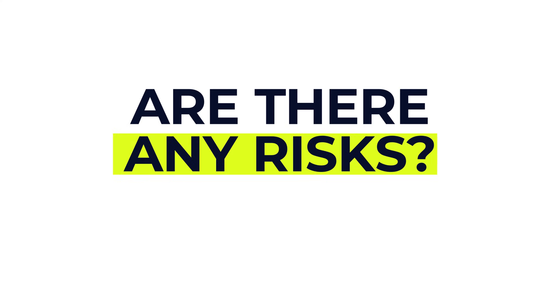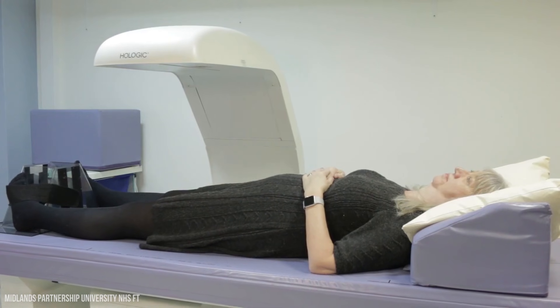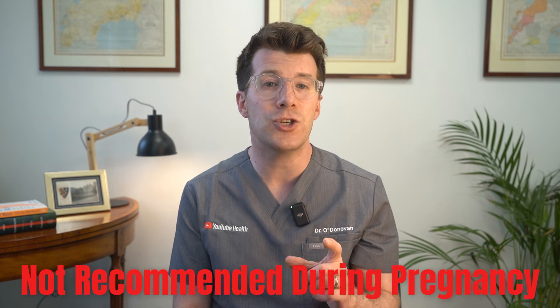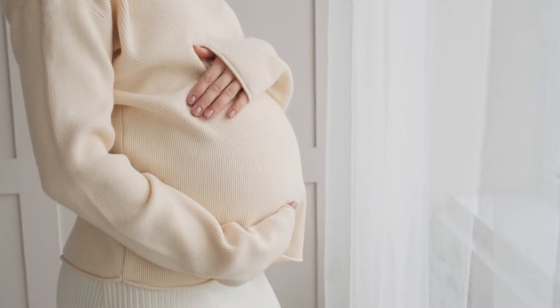Are there any risks with the scan? A DEXA scan is actually very safe. The amount of radiation you're exposed to is extremely low — much lower than a standard x-ray, and safe enough that the radiographer can stay in the room with you. However, DEXA scans are not recommended during pregnancy, just as a precaution, because even low levels of radiation can potentially affect an unborn baby.